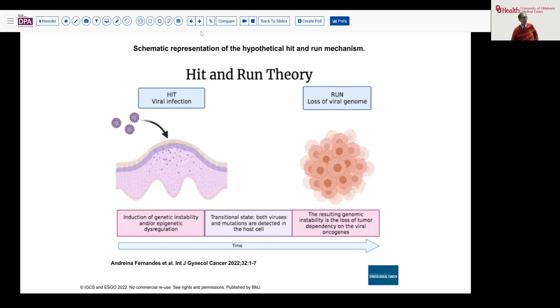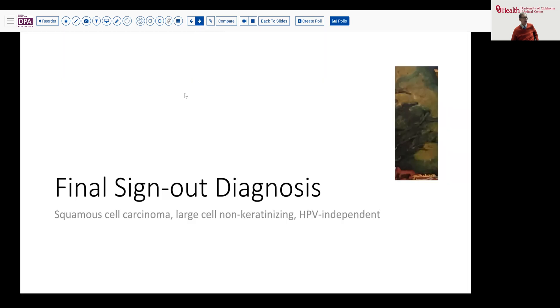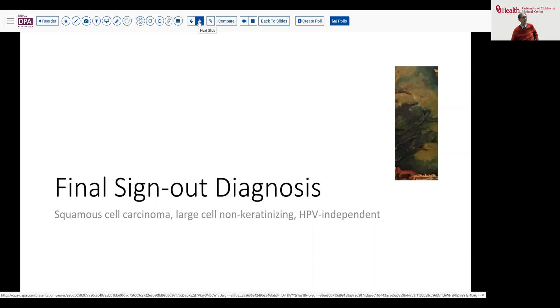Whether this turns out to be true remains to be seen, and it will take a little more investigation — perhaps some of you will be doing that investigation. Our final sign-out diagnosis, based on the findings we've reviewed, is squamous cell carcinoma, large cell non-keratinizing, HPV-independent. That HPV-independent classification is certainly the more important factor here.